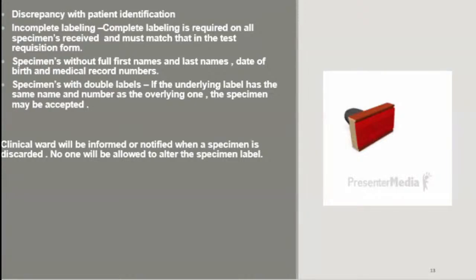Discrepancies with patient identification, incomplete labeling. Complete labeling is required on all specimens received, and it must match that in the test requisition form. Specimens without full names, last names, date of birth, specimens with double labels. If the underlying label has the same name and the number as the overlying one, the specimen may be accepted.